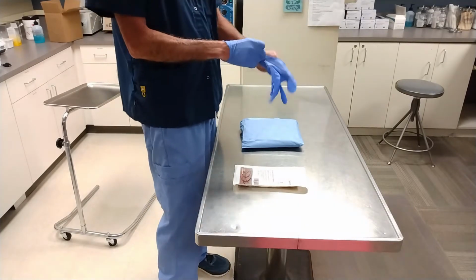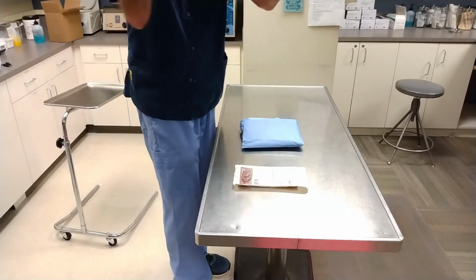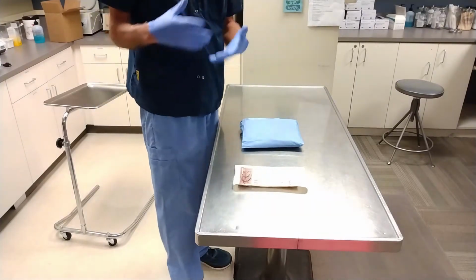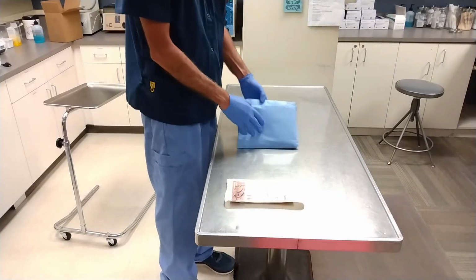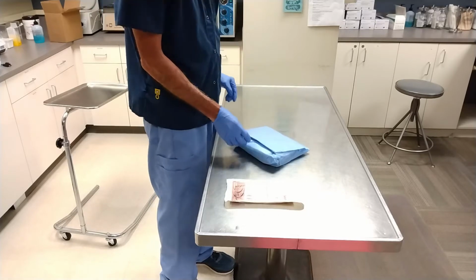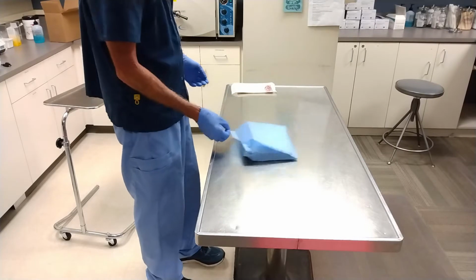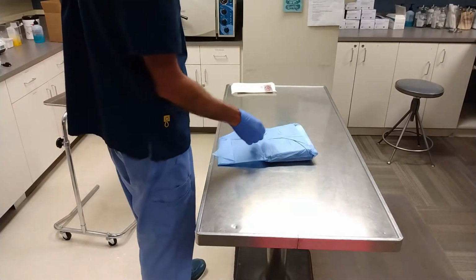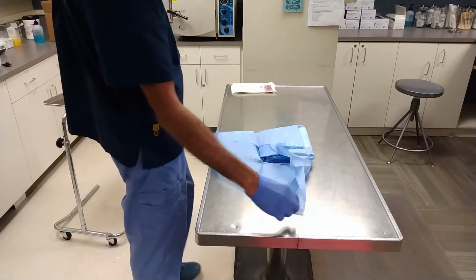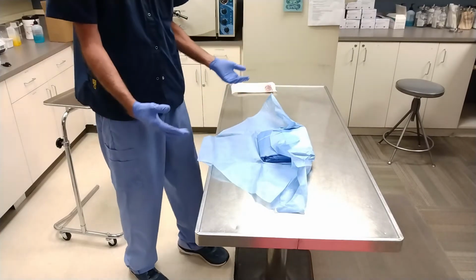So, you know, in a surgical setting, you might be the person who prepares the back table, or you might be the person who's scrubbed in that has to come and get the stuff on. So I'm kind of playing both roles right now. Just like with our sterile wrap, right? You have an obvious little point to grab to open your gown. This one got folded sideways, but I can see that it pulls this way. Like that. So now this is a sterile field.